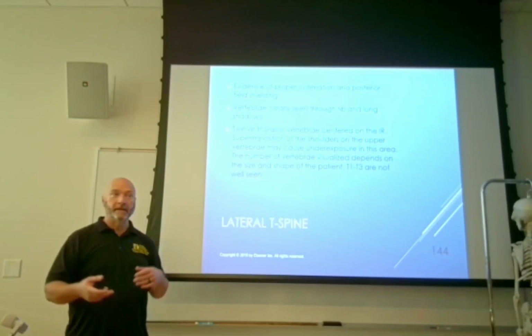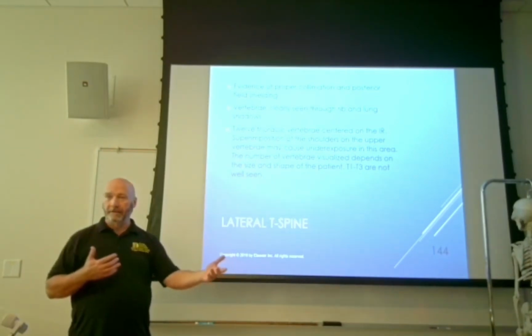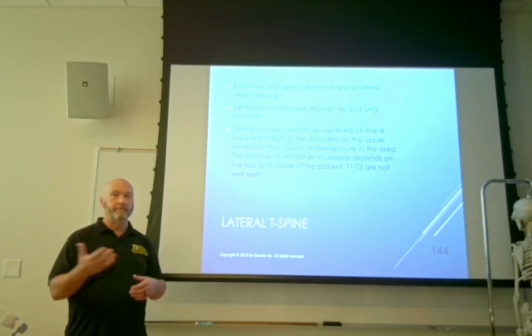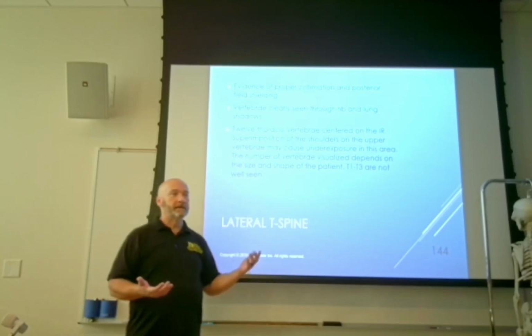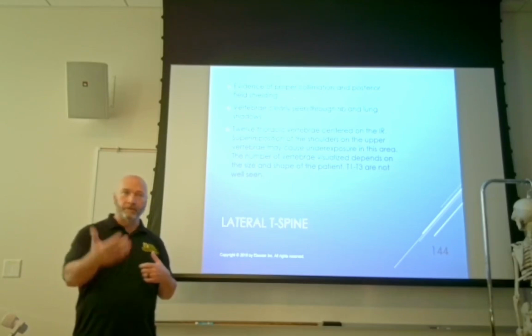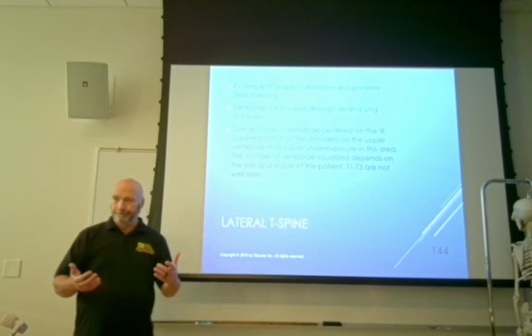Is 200 mA at half a second 100 mAs? Yes. Okay, so that's reciprocity. You're giving up one thing and taking another thing to arrive at exactly the same thing. That is what reciprocity is. The law of reciprocity means that if your machine's shooting right, it doesn't matter what mA and time you're using, the overall mAs is going to control your exposure in the X-ray beam.